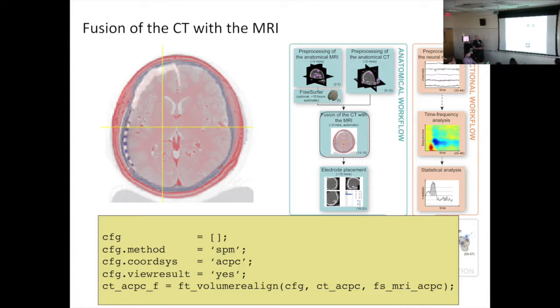And what it is is basically your CT scan and the MRI scan overlaid on top of each other. The CT scan is indicated in blue. And the soft tissue of the MRI is indicated in red. And what you're looking for here is to look for tight interlocking between the high-intensity tissue of the CT and the soft tissue of the MRI. So you want your skull to be in between the anatomy and the scalp captured by the MRI. And the best thing to do is just click a bit around the borders to see if there's a tight match. This is usually where you can spot if you have a left-right flip, which if you don't check carefully, you might spot at this step. You might see that it fits not nicely here on the edges, despite that from a distance it looks like they are more or less aligned. So this is a critical step. It's a control step for all the procedures until now.